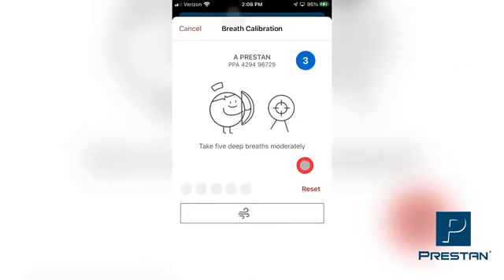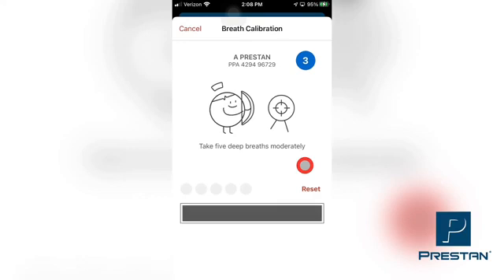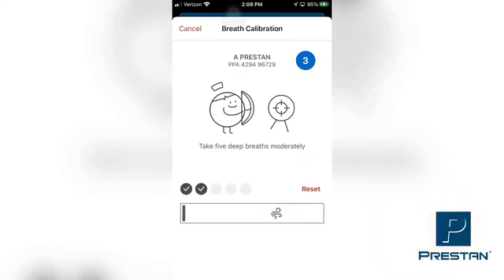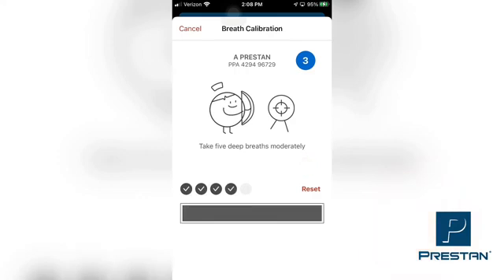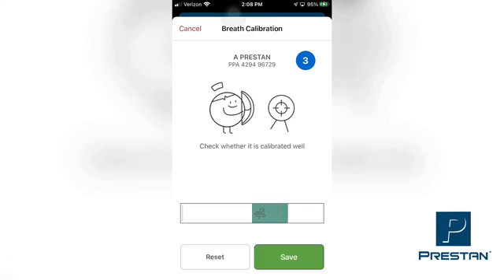Follow the directions on the screen to perform 5 deep breaths into the mannequin. Make sure that you are properly performing the head tilt procedure to open the airway of the mannequin, so that the airway is unobstructed during this procedure. Ensure that the lung bag is inflating and the chest rise is visible in the mannequin. Once 5 breaths are completed, the app page will automatically change and the app will ask you to verify that the sensor is calibrated.